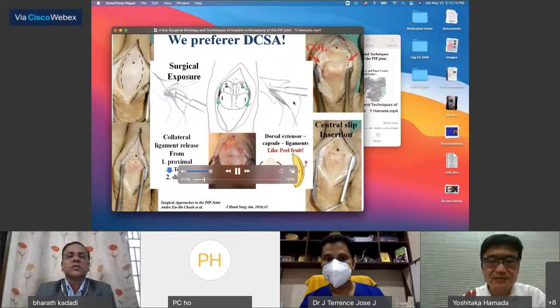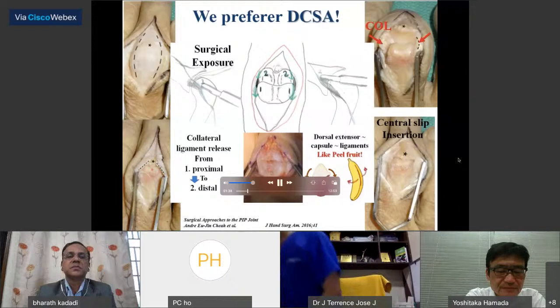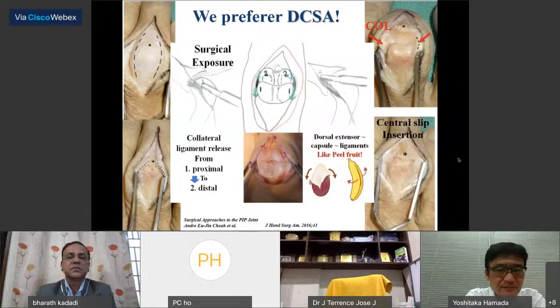Can you hear now? View and easy identification of components such as collateral ligaments, abbreviated COL. This center figure shows the surgical exposure. The articular surface was exposed through a longitudinal split of the central slip with further bone exploration.